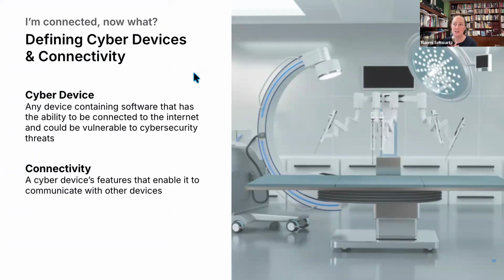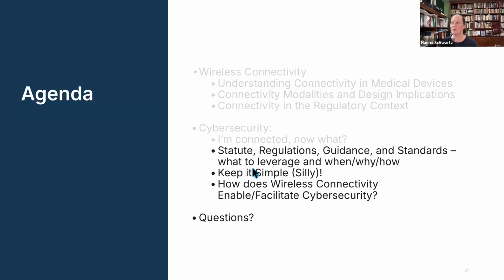But FDA's definition of a cyber device is really any device that contains software that has the ability, not your intention, but the ability, a capacity, intended or not, to connect to the internet, and that could be vulnerable to cybersecurity threats. I would go so far as to say if you have software, you could be vulnerable to cybersecurity threats. So those two are, in my mind, somewhat redundant. But connectivity is really that cyber device's features that enable it to connect to other devices.